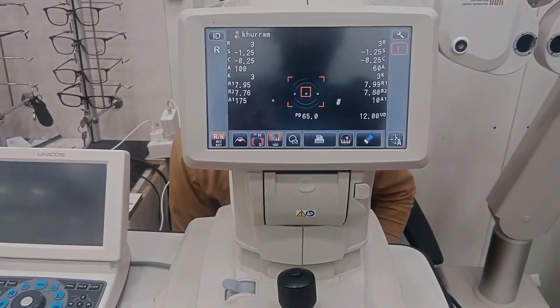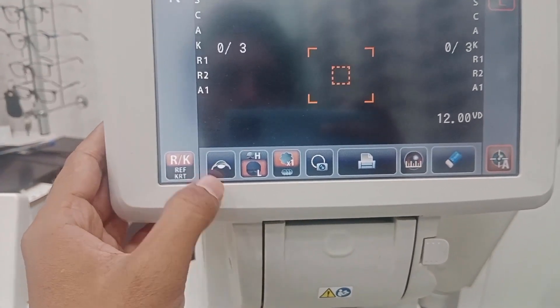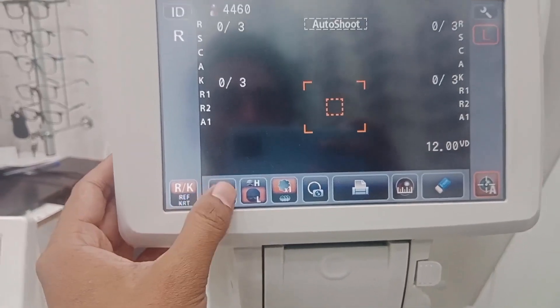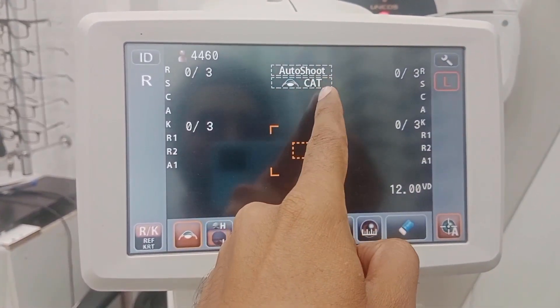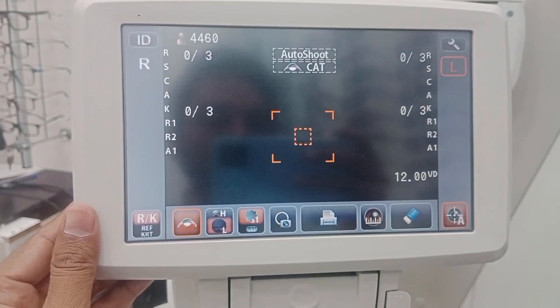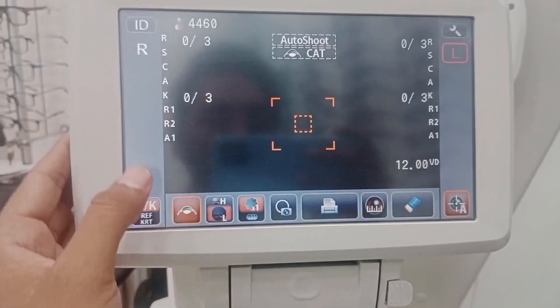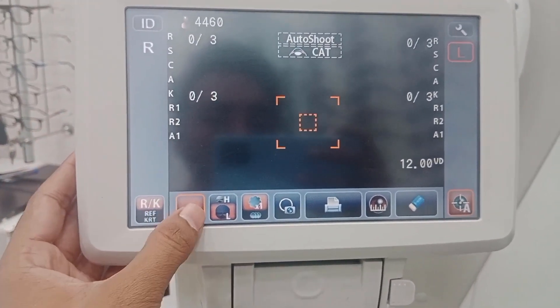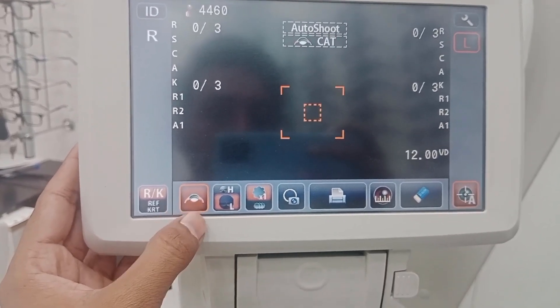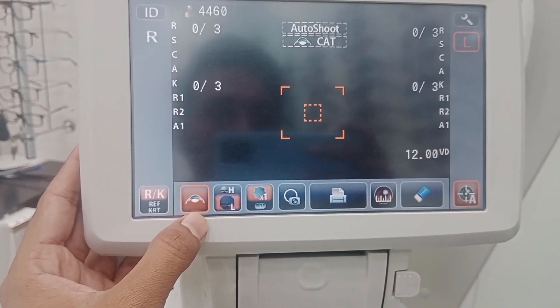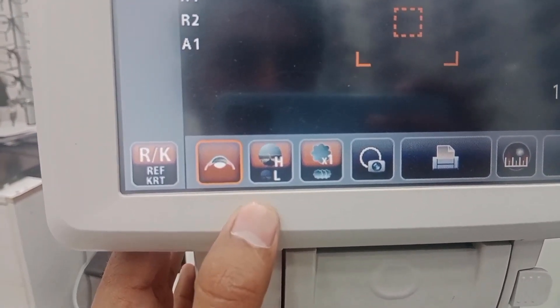This is an important setting called auto shoot cataract. You can diagnose cataracts easily with this setting if the patient is cataractous.